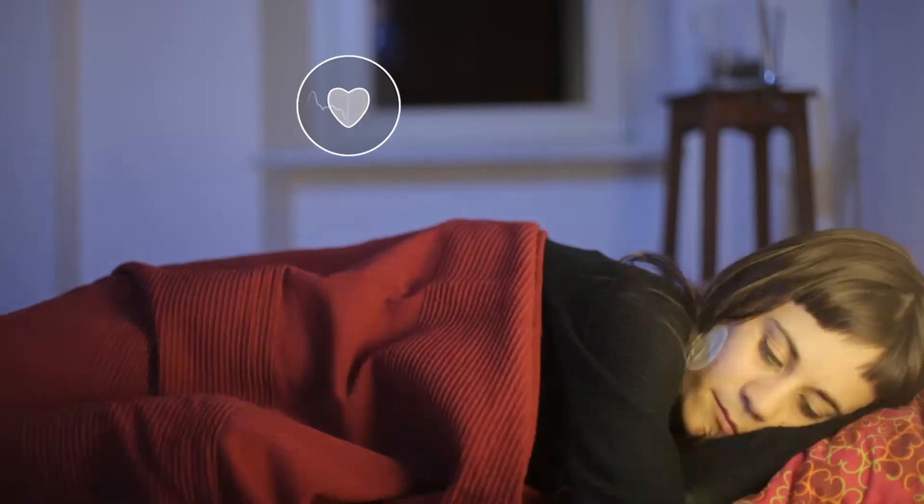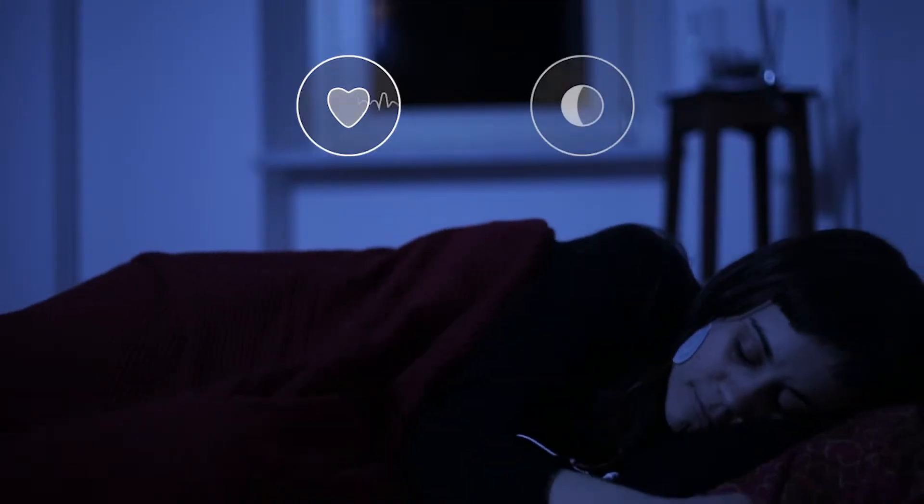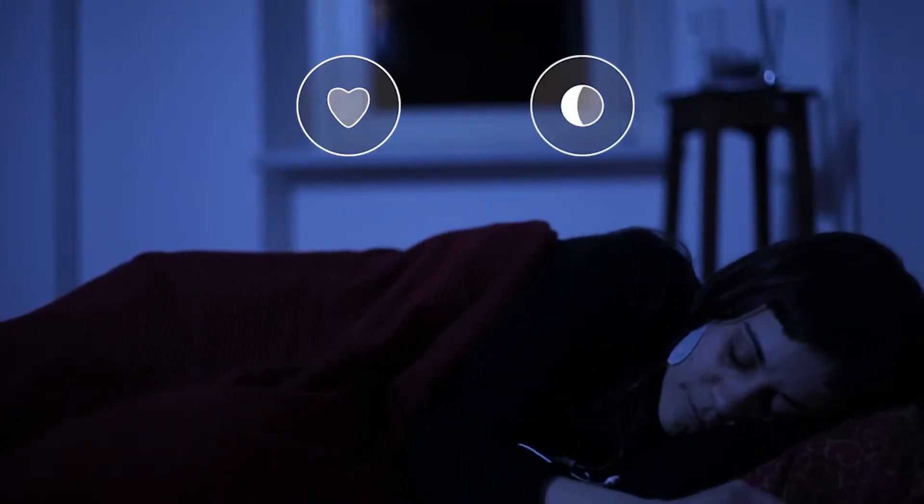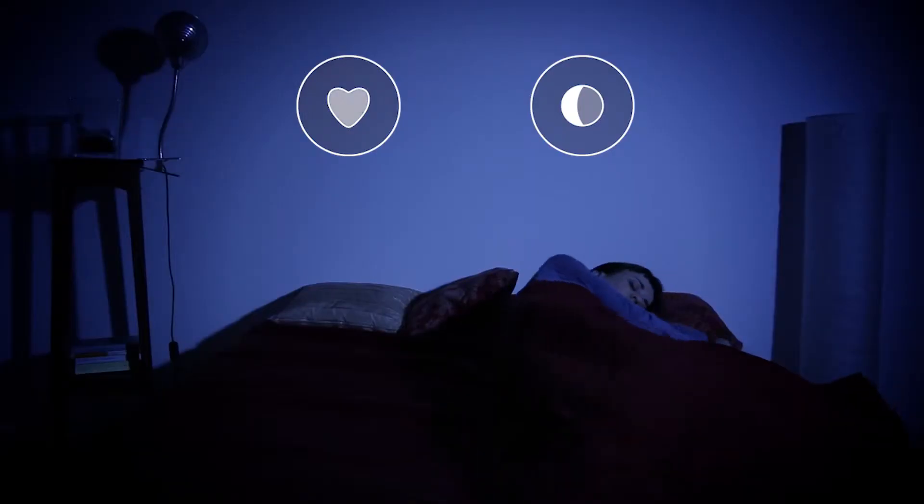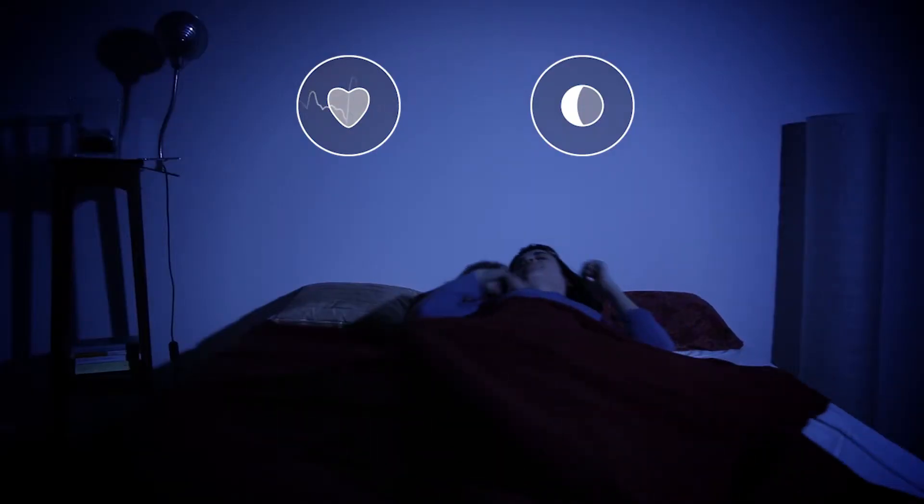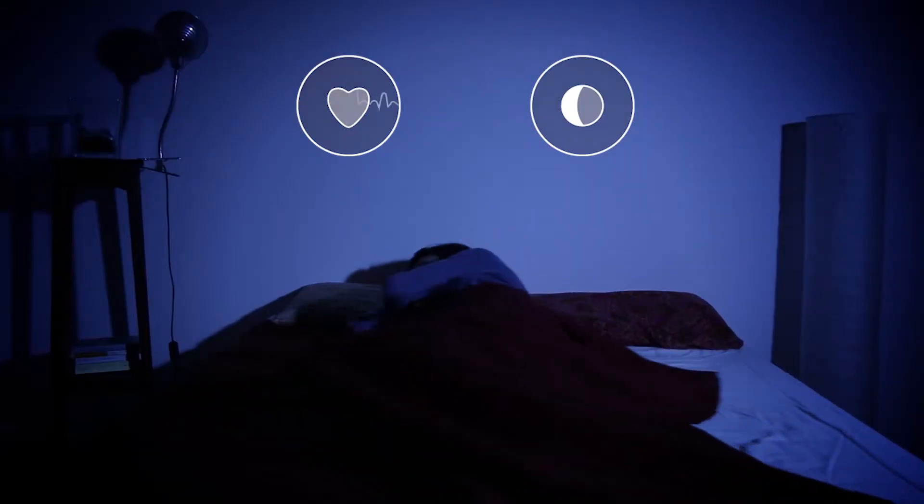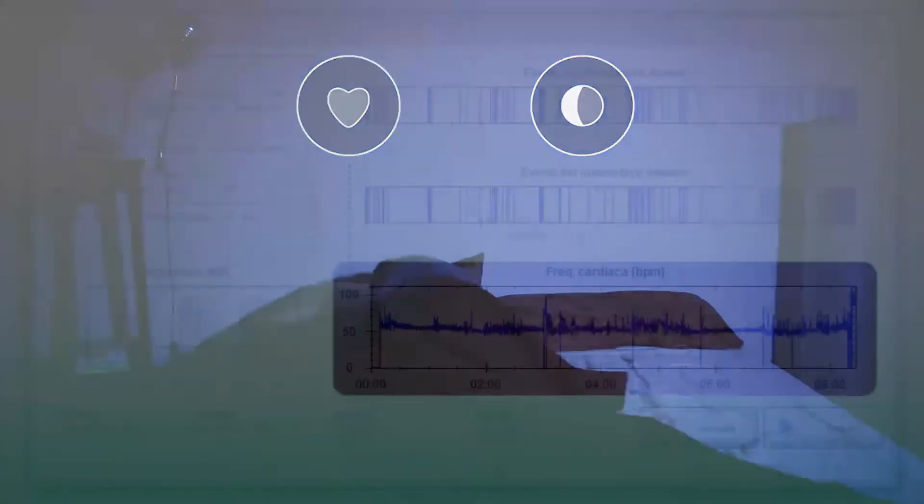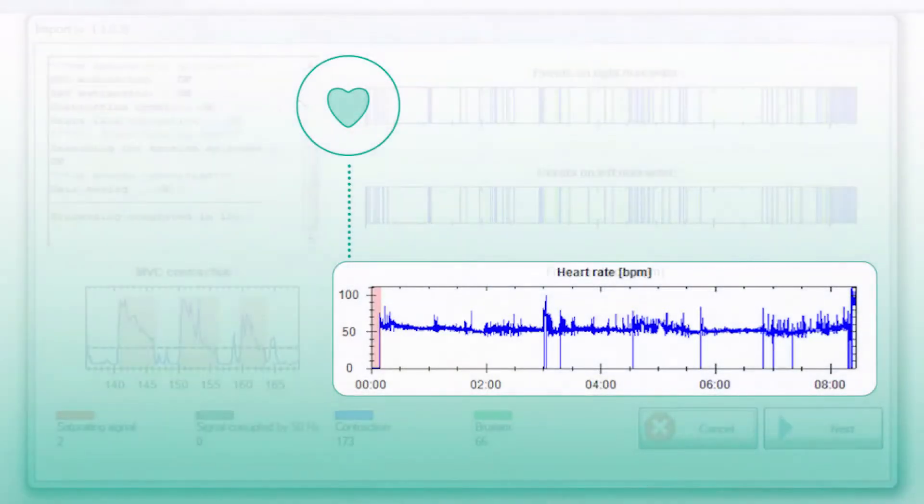If the patient moves too much during their sleep, the heart rate signal could be masked by excessive contractions of the left pectoral muscle, in which case zero values are inserted.